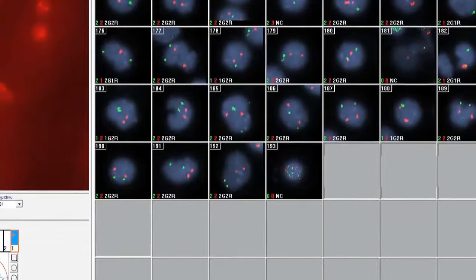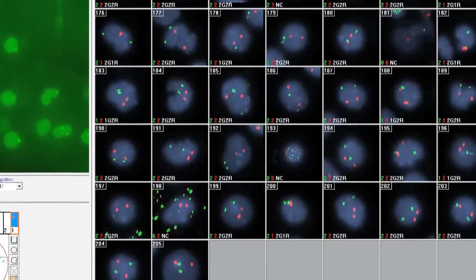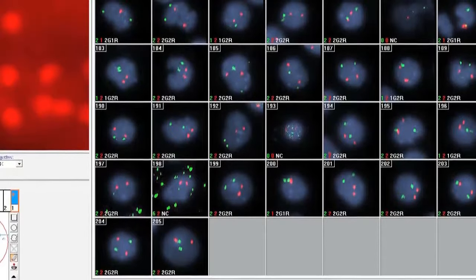As the Genesis system scans the slide, each individual cell is segmented and scored according to multiple parameters, including size, shape, and signal pattern.